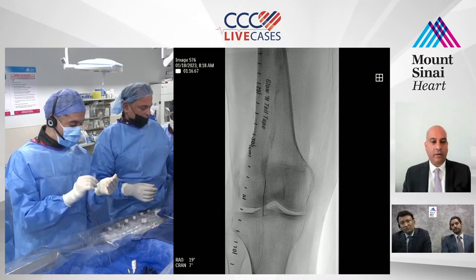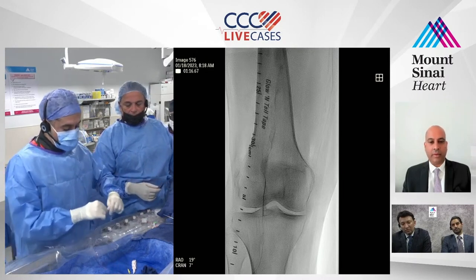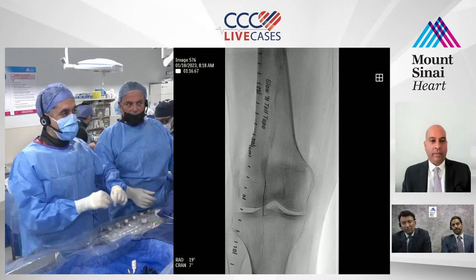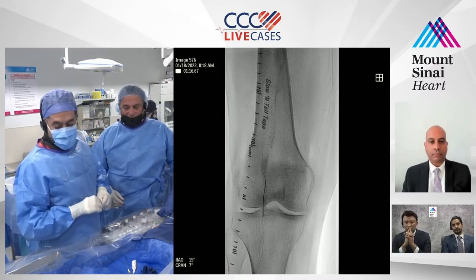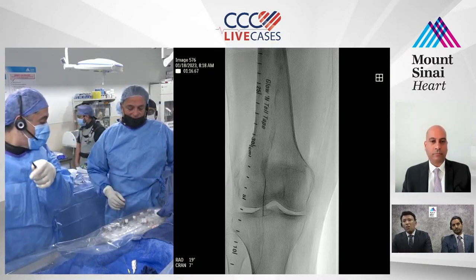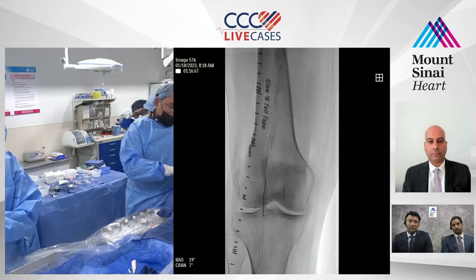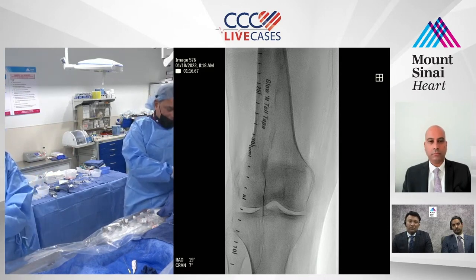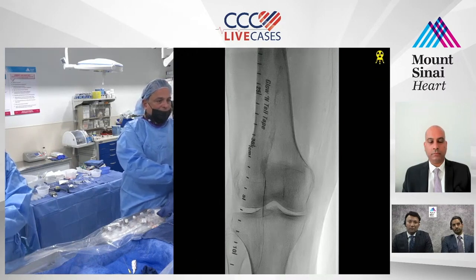Original idea. It's too bad we couldn't do an endarterectomy and kind of convert this to a hybrid approach, right? That would have been ideal. Yeah. Well, the last thing you want, and Ajit and I spoke a lot about this, is an infection. And this lady, like I said, is quite symptomatic. And I'm worried about the endarterectomy. I don't want any infection to occur. So I know it's worrisome.